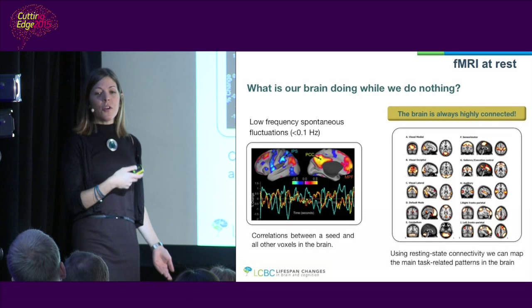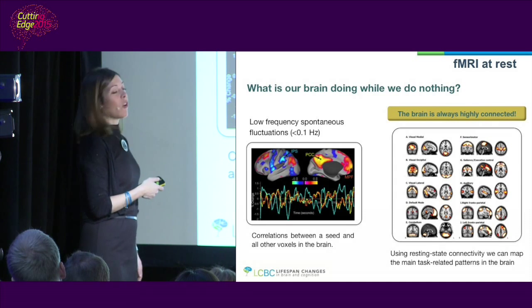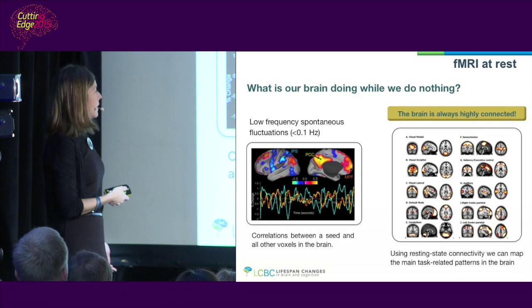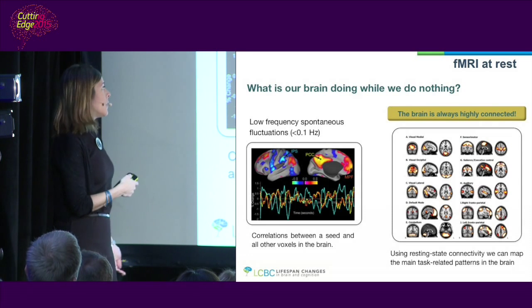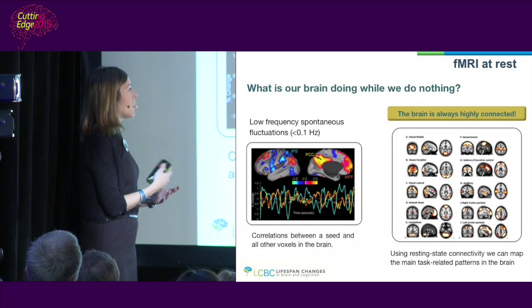So there are some low-frequency fluctuations that are correlated across all the brain. So then we can map things like this. These areas will be connected to these other areas in the frontal, but they are very far away. So it means that something would be happening that makes them be connected.